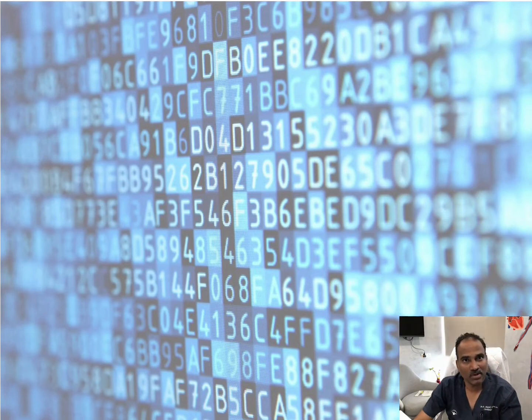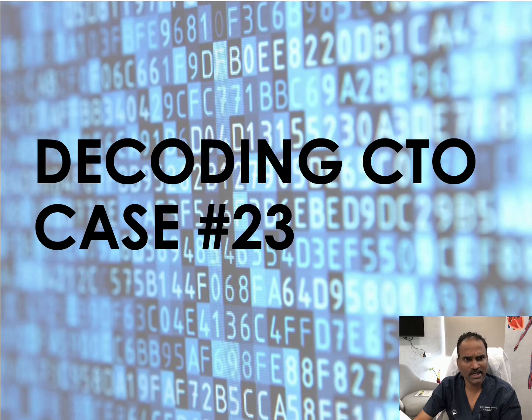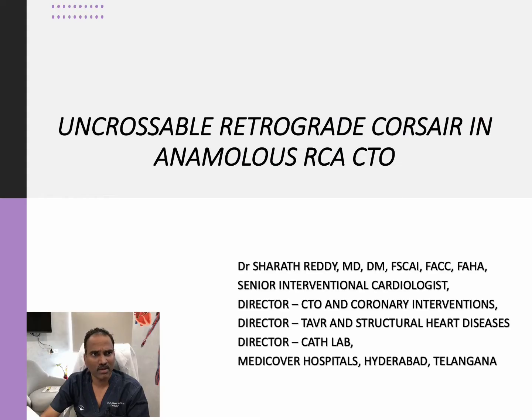Yeah, so welcome to today's Decoding CTO session, case 23. Today I'm bringing a case of right coronary artery CTO with uncrossable retrograde Corsair. I'm Dr. Sharath Reddy, interventional cardiologist, Medicover Hospitals, Madhapur.